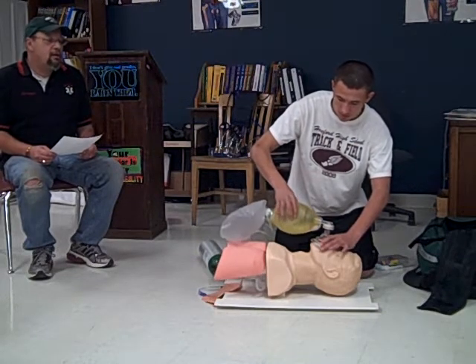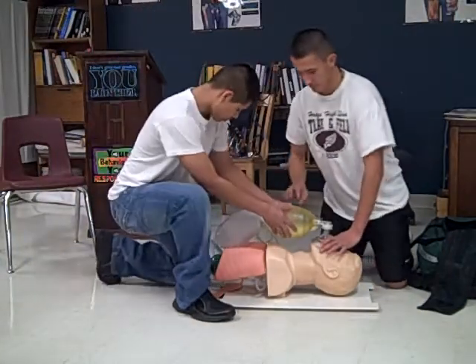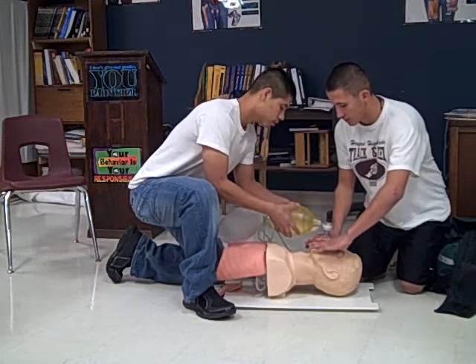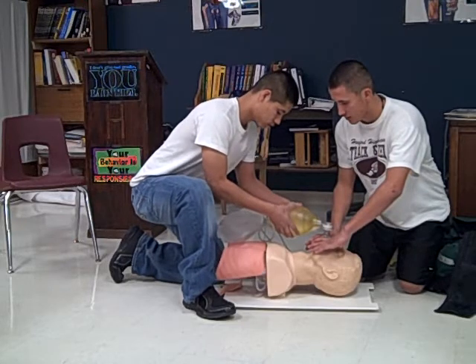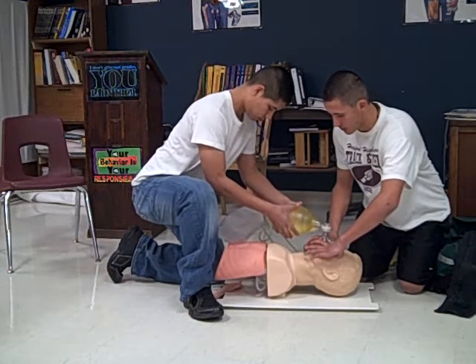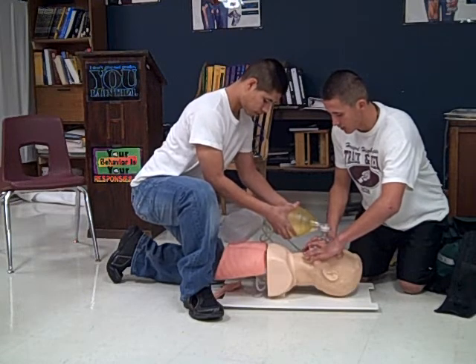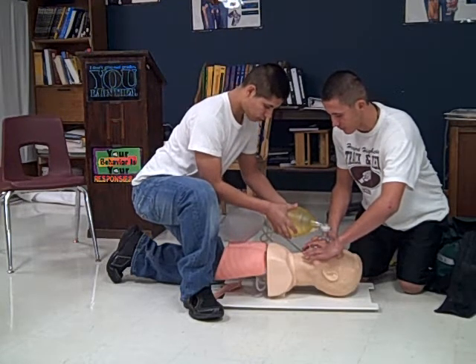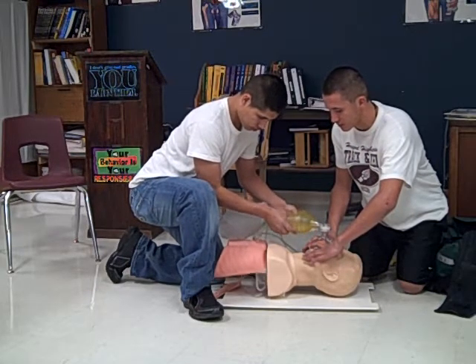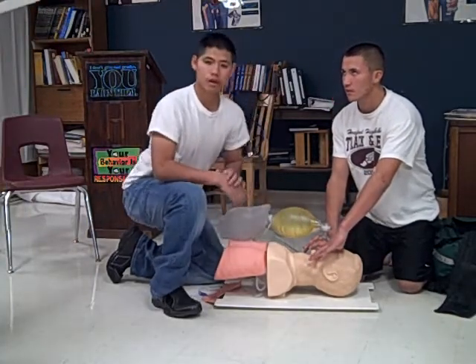I will lay it down and begin ventilations. You have another EMT who has arrived on scene — they will ventilate the patient. You need to control the mouth mask seal. I will open it up. Now I will see you ventilating the patient with a high concentration of oxygen for approximately 30 seconds.